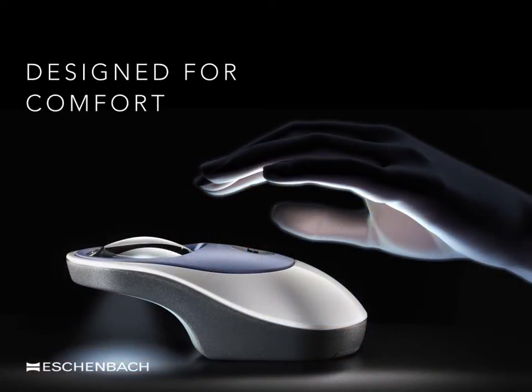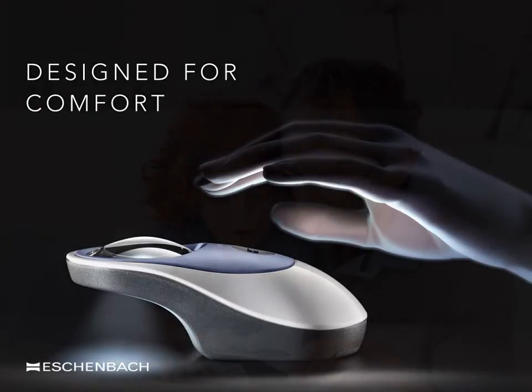Much attention has been given to how a patient holds and moves a device. In the award-winning Parallux range of magnifiers, the magnifier molds comfortably into the hand. It is also possible to place a pen beneath the Parallux lens. With a simple symmetrical design, either hand can be used to move the magnifier when necessary, suiting both left- and right-handed users.